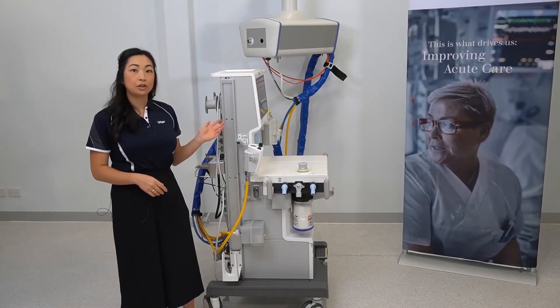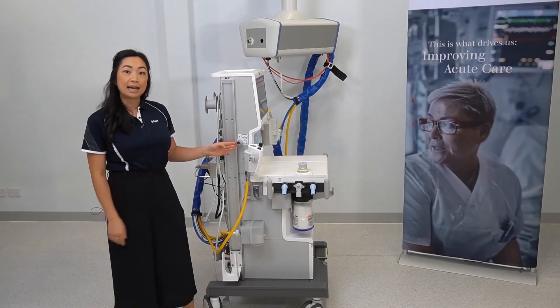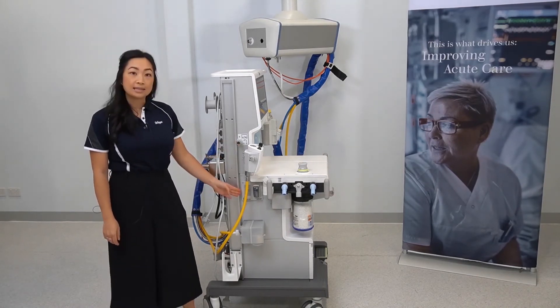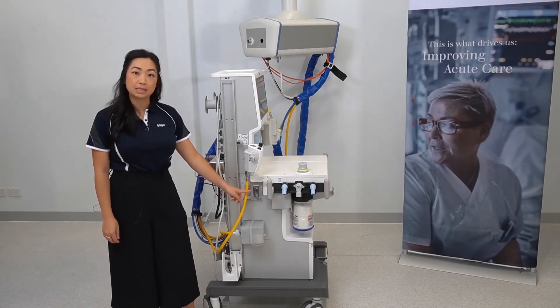This is a side view of the ATLAN A350. Located here is the external fresh gas outlet for your non-rebreather circuits such as the Ayers T-piece. This is where your gas bench would be installed if it's available on your device, and the water trap is located here.